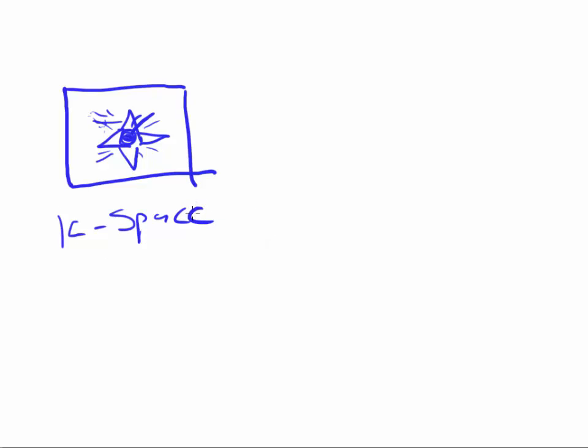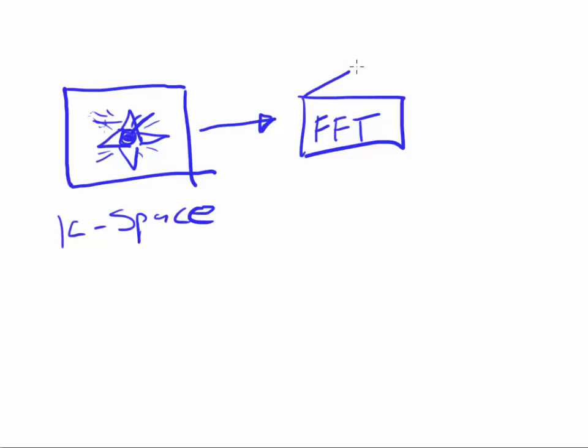Now, this wouldn't do much good for a radiologist. Looking at this star pattern wouldn't help him too much in discerning what is going on inside of your body. So, we need to decode this information. And to do that, we use a mathematical concept called a fast Fourier transform. Now, don't be too concerned about that. If you want to think of it as simply a black box, that is just fine, or a decoder for that matter. So let's put decode here.